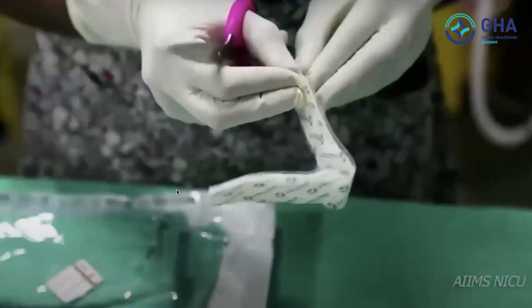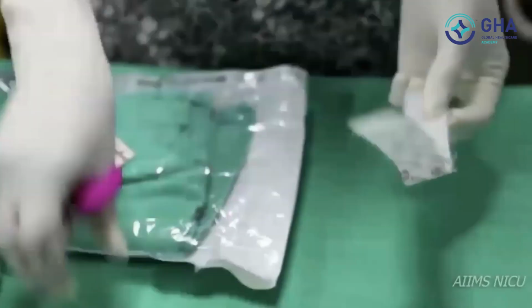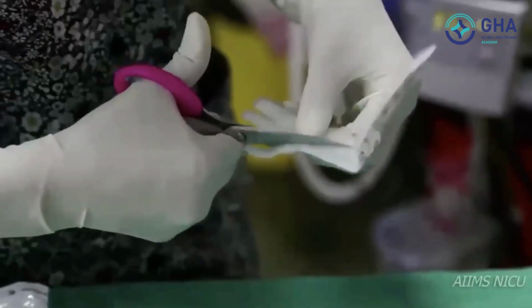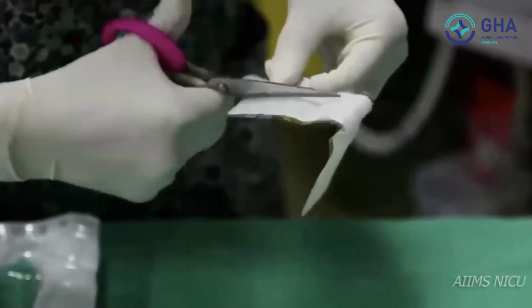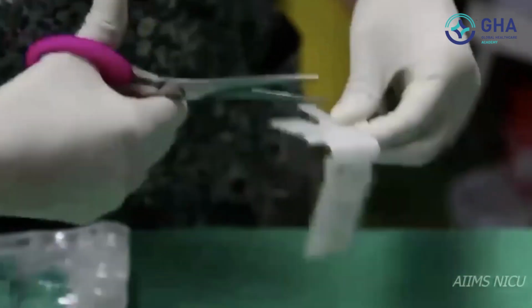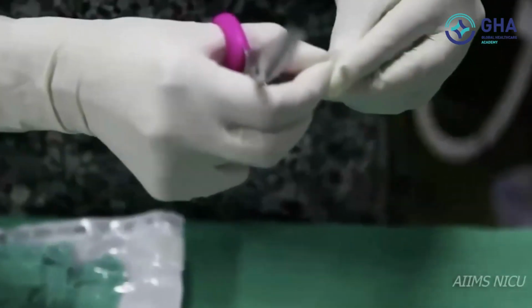Open the Velcro. Cut the soft Velcro which is to be fixed on the prongs. Cut the rough Velcro of appropriate shape which will form the base on the philtrum.